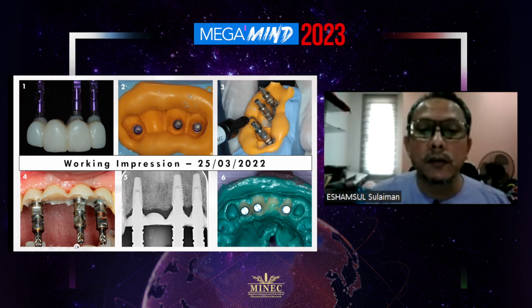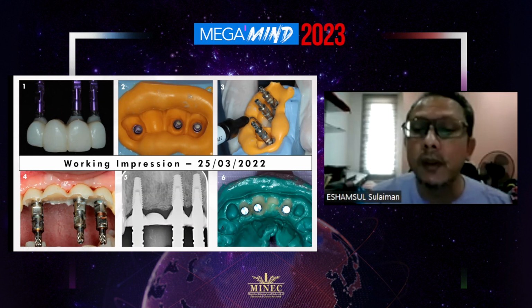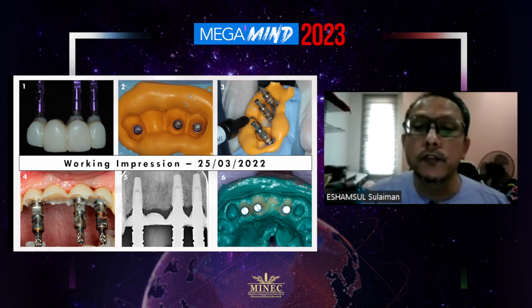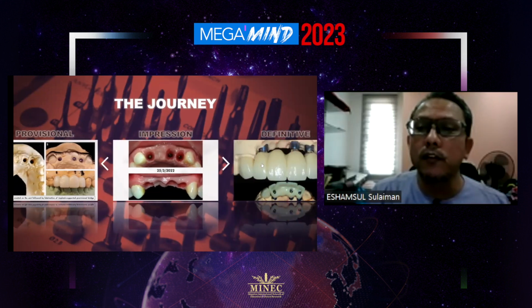And following that, the intraoral periapical radiograph was taken to confirm the full seating of the coping. And immediately after that, the impression was taken using polyether Impregum Pentasoft. And following a month after that, the final restoration was received from the lab.